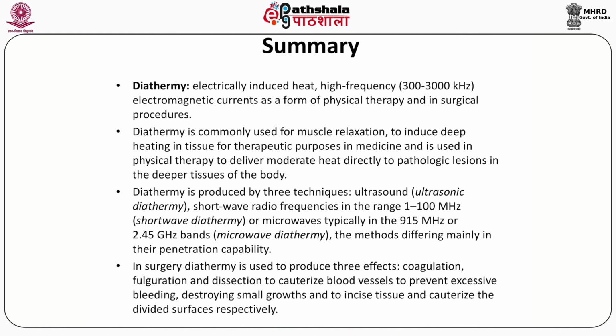We have talked about the various uses and techniques of diathermy, and we have seen its use in physical therapy and in surgical procedures. Let's summarize today's module. Diathermy is electrically induced heat using high frequency electromagnetic currents, in the range of 300 to 3000 kilohertz, as a form of physical therapy and in surgical procedures.